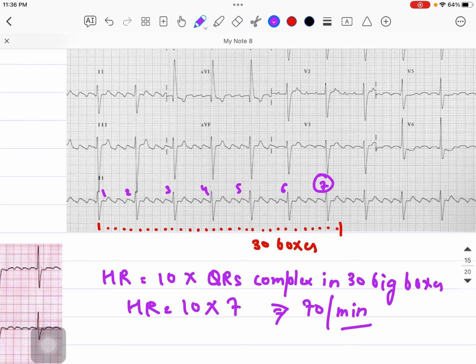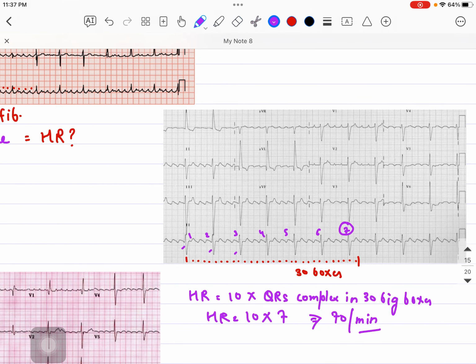Okay. So once again guys, the patient is having almost a narrow QRS complex, right? And if you look at the rhythm of this patient, the RR interval over here, in the second lead, you will see more than 4 bigger boxes, right? So that is the thing over here. So that is how to calculate the heart rate in the patient who is having the irregular RR interval, that is the formula. Okay, fine.